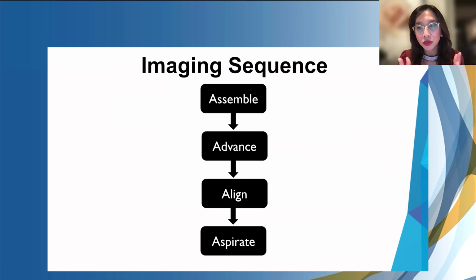Because it's the tricuspid, where exactly is the vegetation? Is it on the anterior, posterior, or septal leaflet? In terms of trajectory, the 3D really helps with the trajectory of the catheter, and which devices and catheters to use on your end. Once you have aligned the trajectory, that's where you aspirate.